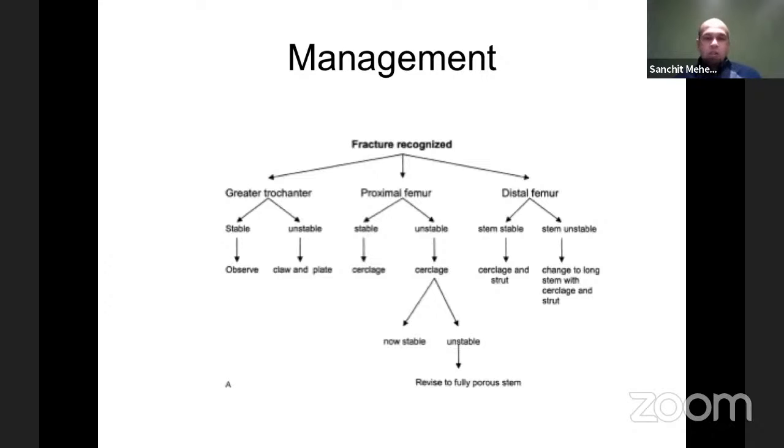In the past, we used to say that once the trochanter escaped, it's escaped. But now, there are good fixation devices available for the greater trochanter. So it's worth having them on the shelf for if and when you have greater trochanteric fractures. They tend to be more common in revision surgery. Greater trochanteric fractures are uncommon in the primary scenario unless the anatomy is grossly altered. The more common ones are the proximal femoral ones.